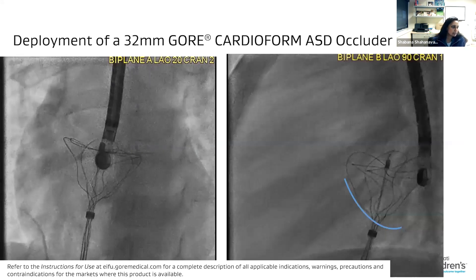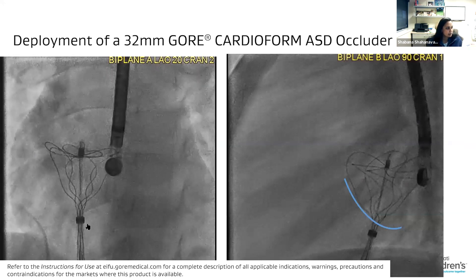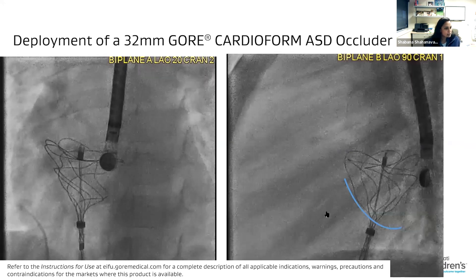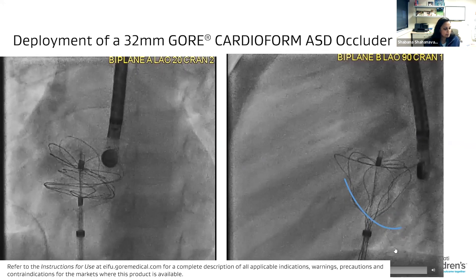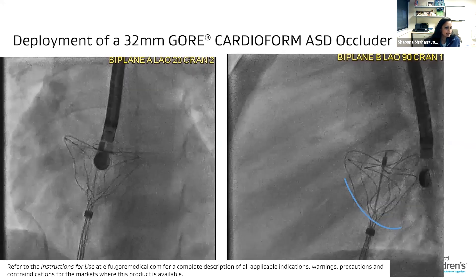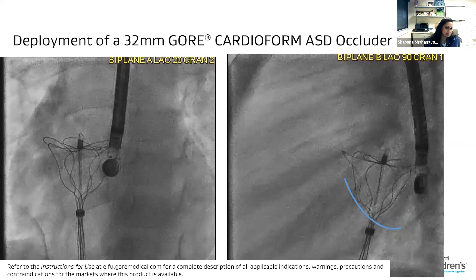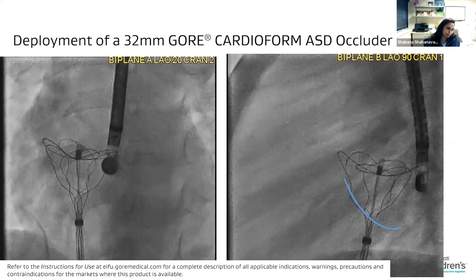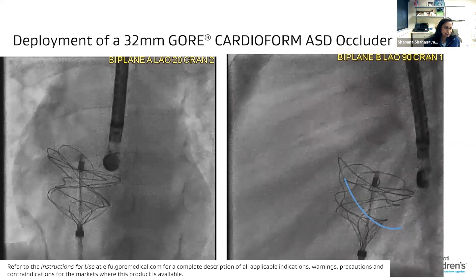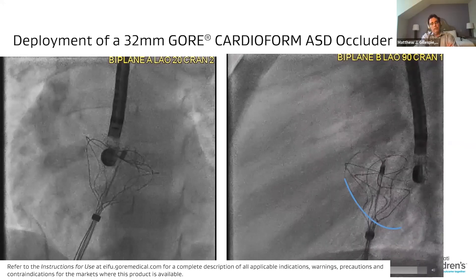You'll see here that the whole disc is being rotated — the whole delivery system is being rotated as we deploy it. This is the plane of the septum, and as we deploy it and pay attention to that, you'll see it fall a little better onto the septum itself. And you'll see that separation between the discs in both projections.